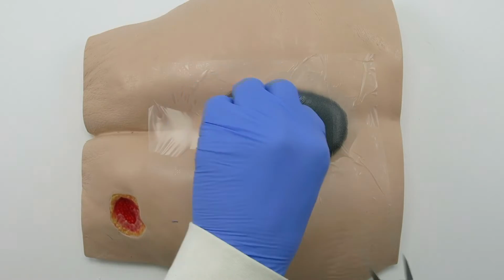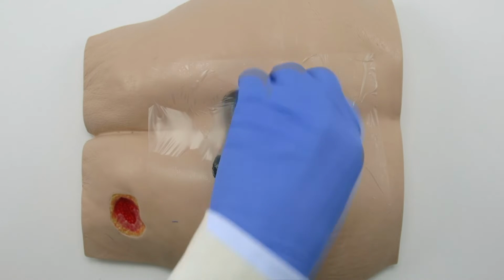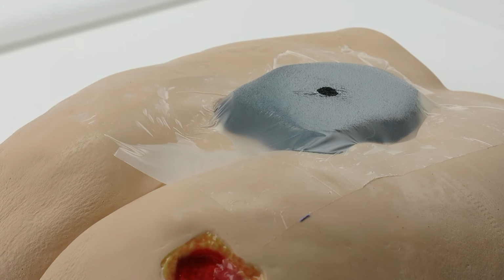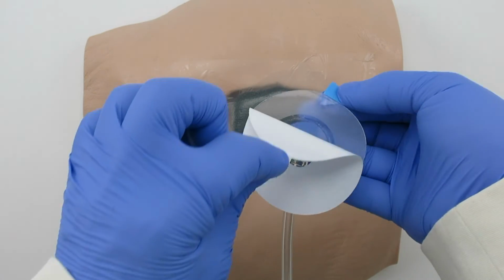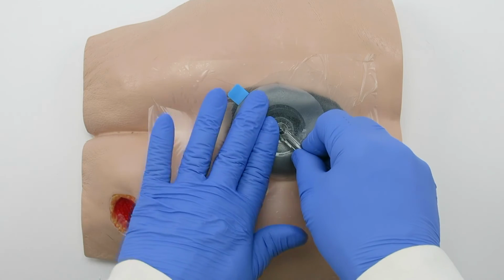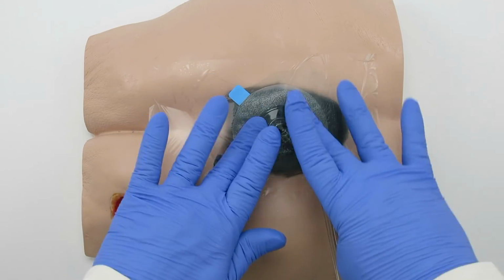Decide the best location to place the speed connect. Cut a 1 centimeter diameter hole in the drape. Do not cut an X or slit. This may prevent proper delivery of suction. Remove the speed connect backing and place with the lumen over the opening on the drape. Smooth the adhesive interface to promote bonding. The blue tab remains on the speed connect border.